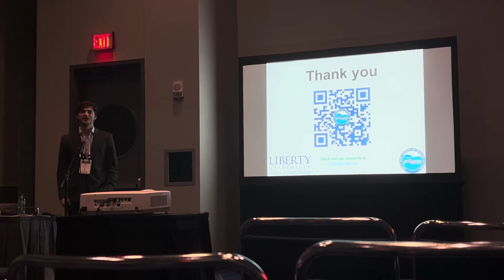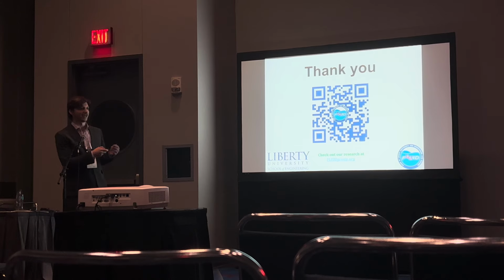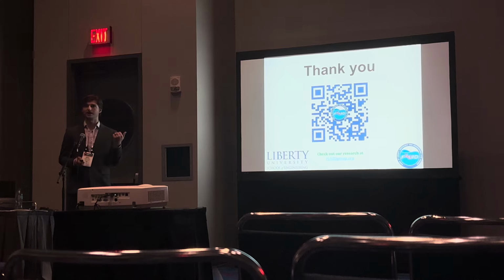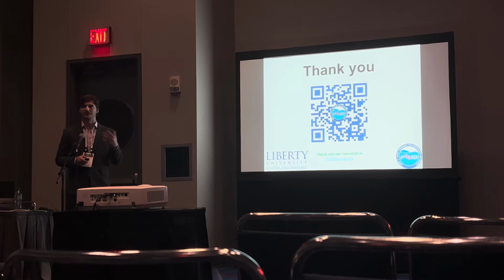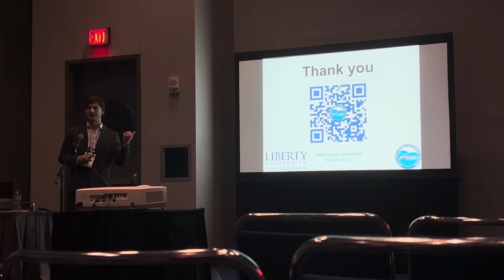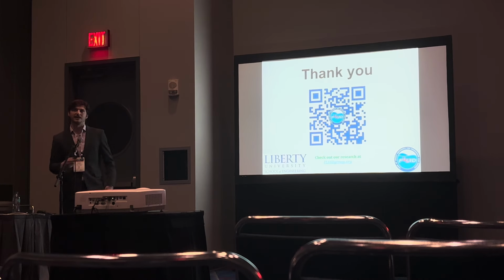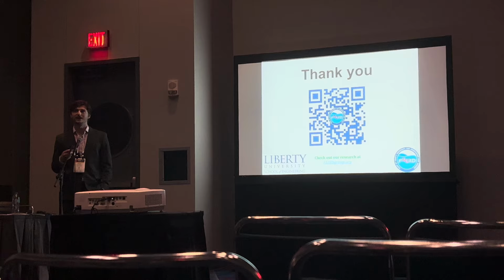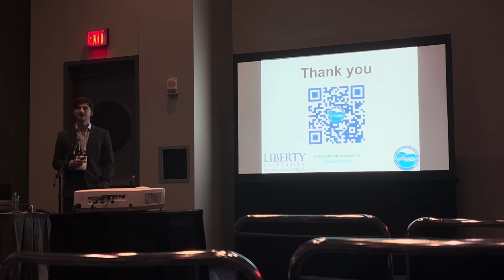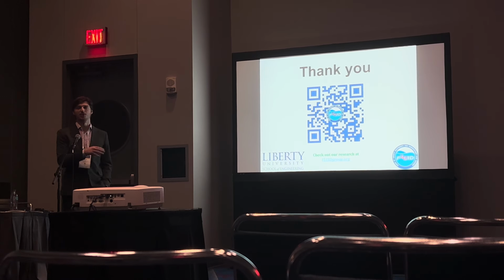Yeah, that's a great question. So I mentioned at the beginning that Vapotherm was the funder of this project. They have an experimental setup using an ASL 5000, a breathing simulator, and they 3D printed an airway to exactly match our setup, and they collected oxygen information, and then we validated against that information. We also had a mesh independence study, a time step independence study, and we tested some different solver settings. But in terms of actual experimental information, it was a bulk oxygen metric.